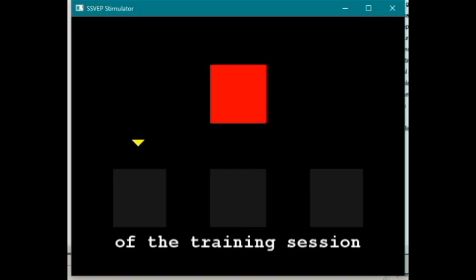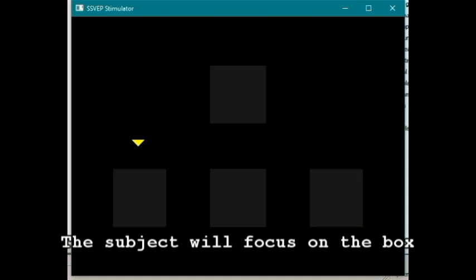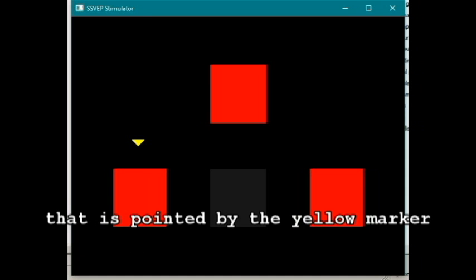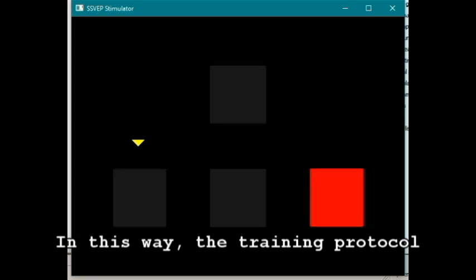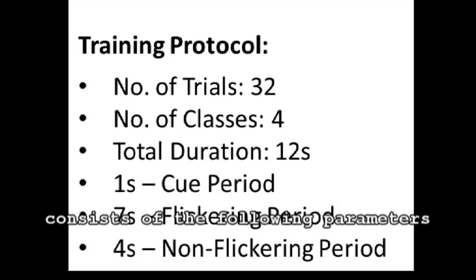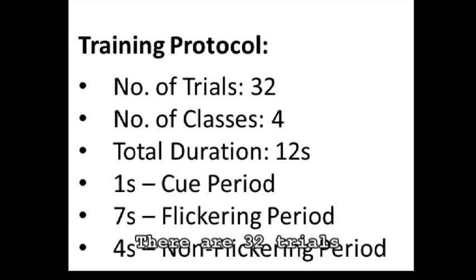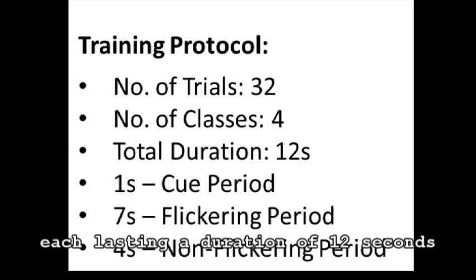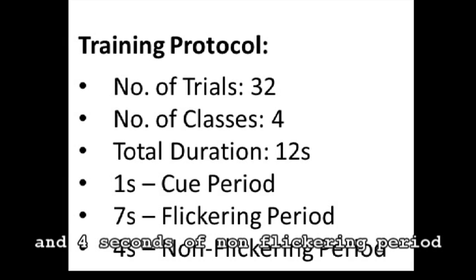Now here is an example of the training session. The subject will focus on the box that is pointed by the yellow marker. In this way, the training protocol consists of the following parameters. There are 32 trials, each lasting a duration of 12 seconds. That includes the 1 second cue period, 7 seconds of flickering period and the 4 seconds of non-flickering period.